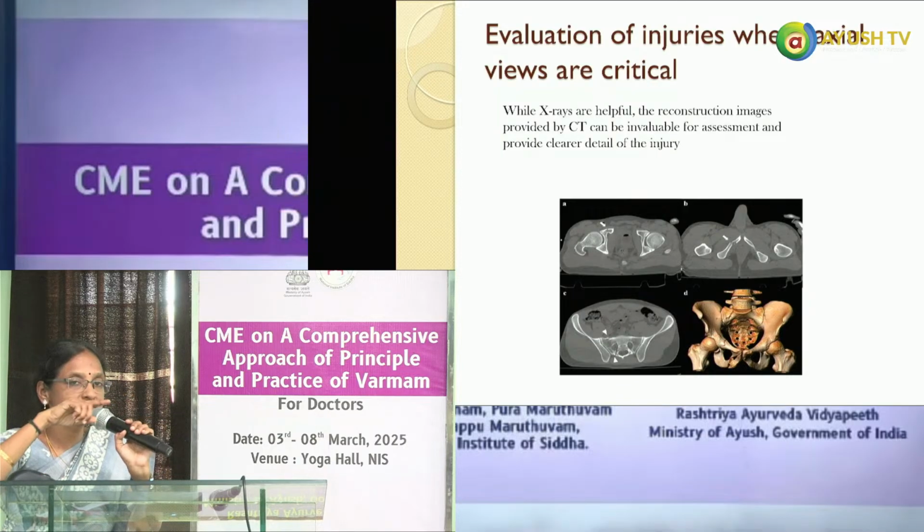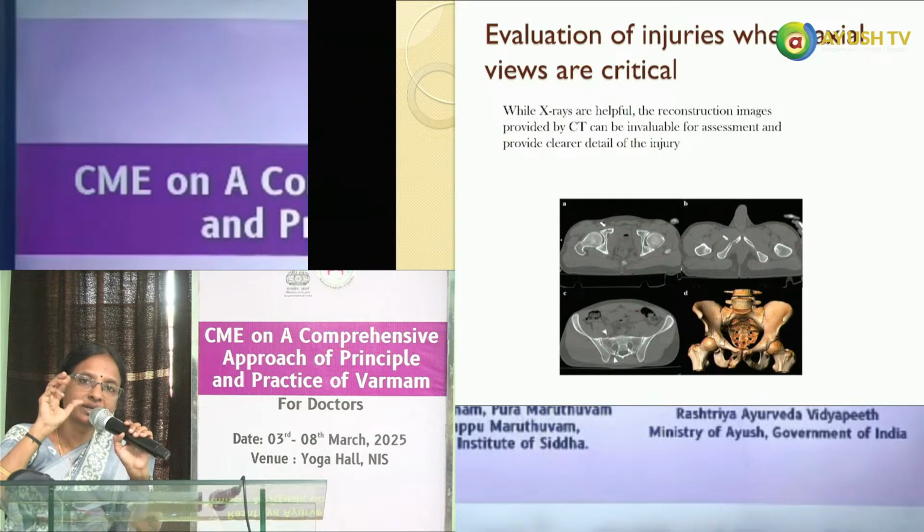So கீழ இருக்கிற picture தான் axial, sagittal, coronal மூணும் reformation பண்ணி ஒரு 3D மாடல் மாதிரி கொடுத்திருக்கிற picture is the last picture. You have a normal bone ஓட 3D மாடல் மாதிரி.